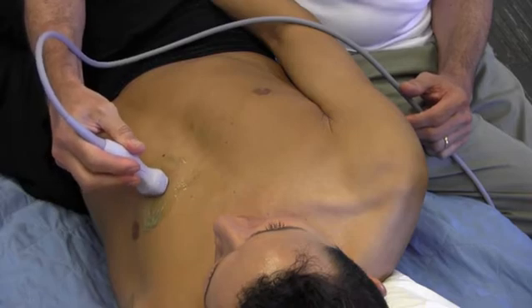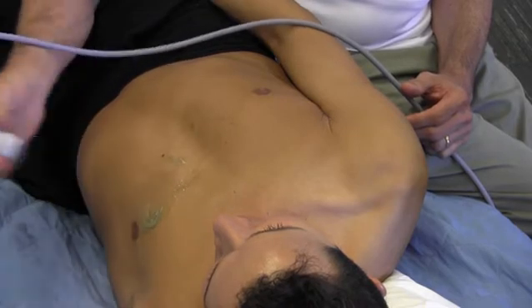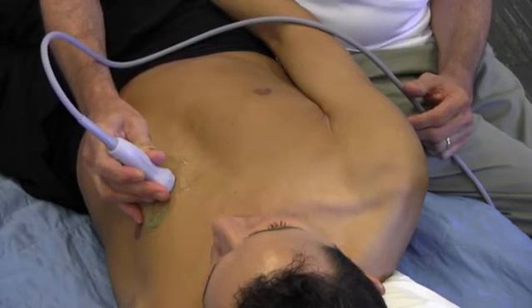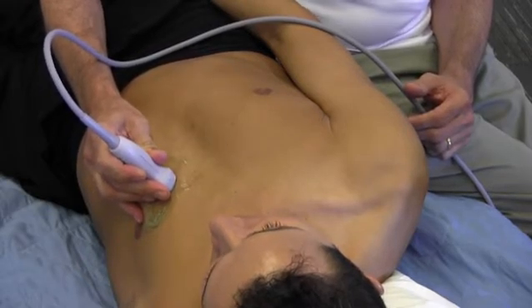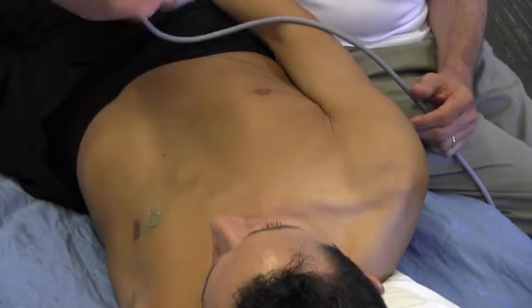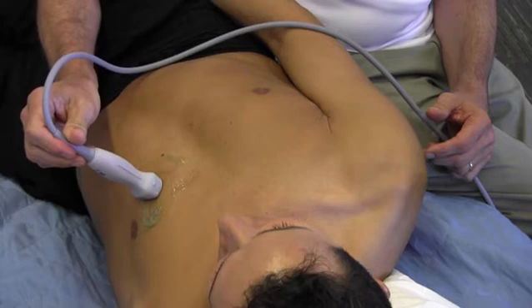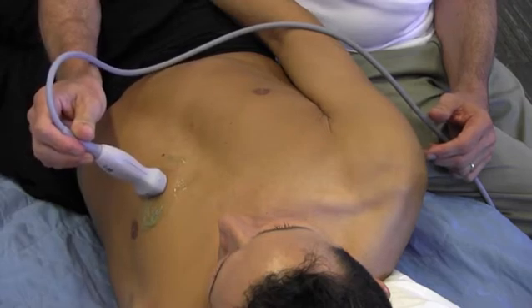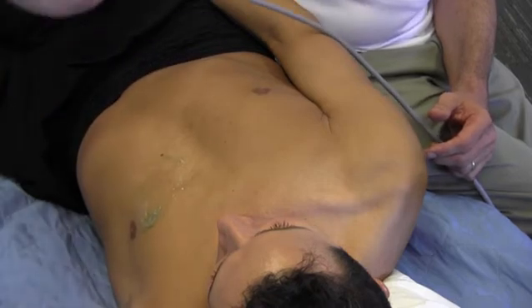Finally, the examiner adopts the correct hold, which is a pencil hold with the hand firmly on the chest. Ultrasound brings you closer to your patients. You have to have your hypothenar eminence on the patient's chest wall, stabilize your hand so when you do your rotation movements and tilting and angling, you have stable images that you are making small adjustments to.